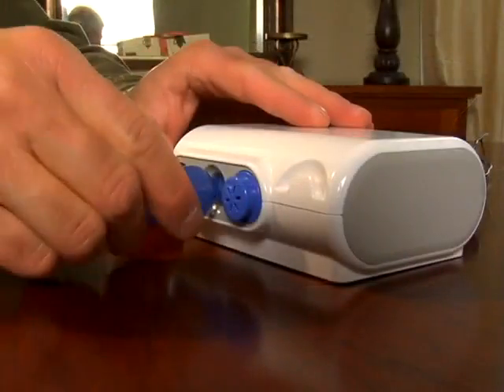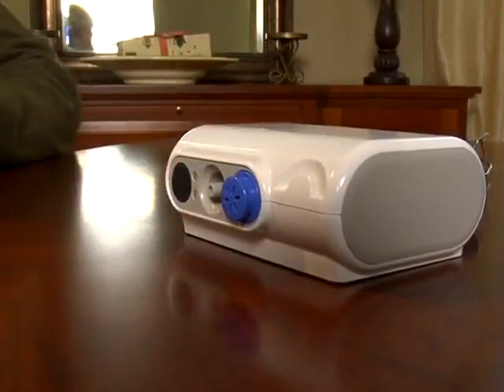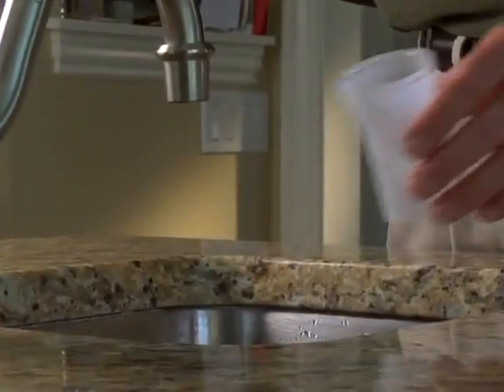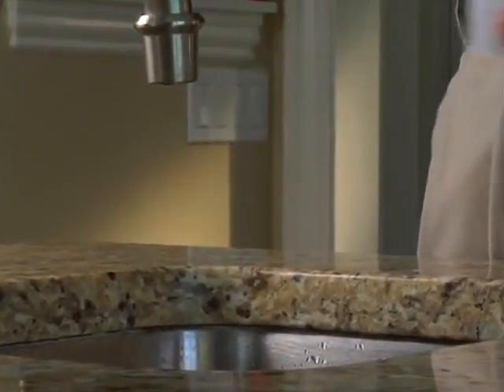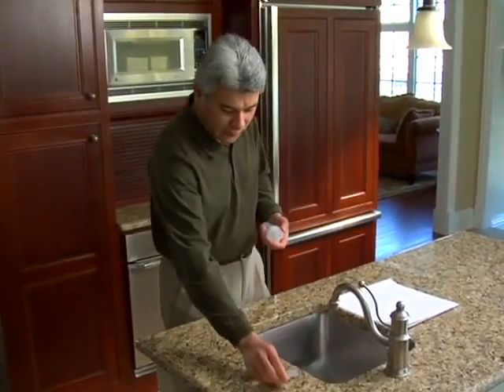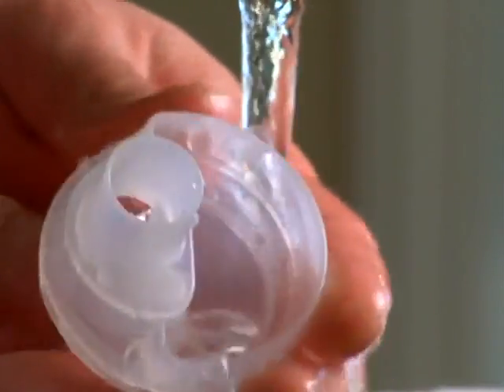Next, remove the air tube from the compressor and unplug the unit from the power outlet. Discard any medication in the medication cup. Before you use your nebulizer kit again, clean and disinfect the parts before using them.